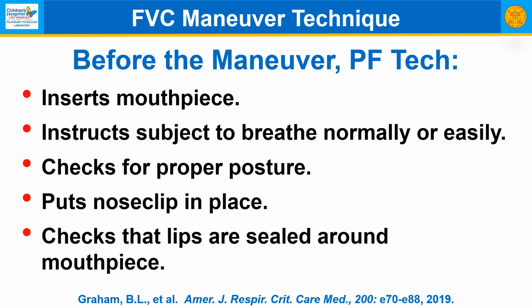So, before the maneuver, the pulmonary function tech inserts the mouthpiece, instructs the subject to breathe normally or easily, checks for proper posture, puts the nose clip in place, and then checks that the lips are sealed around the mouthpiece.